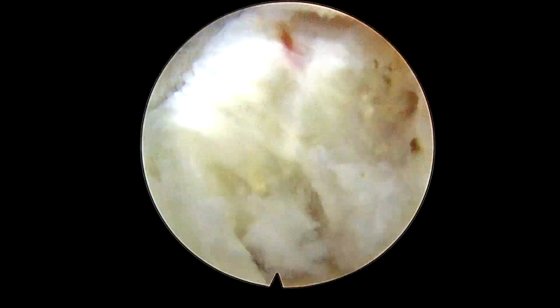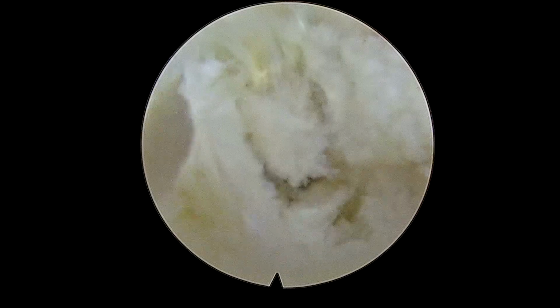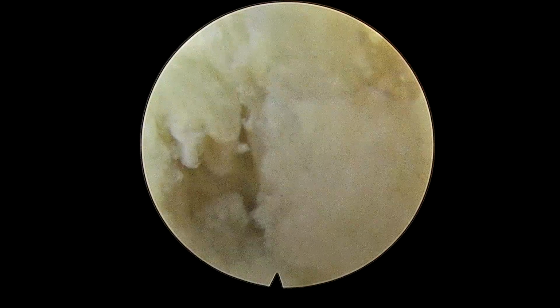In the end, what I do is put the tip of the radio frequency ablator inside, and just burn or shrink all the free fragments which are the potential cause of recurrent disc prolapse. I'll put the tip of the radio frequency ablator inside the disc and burn as much disc fragment as possible, and then I come out.